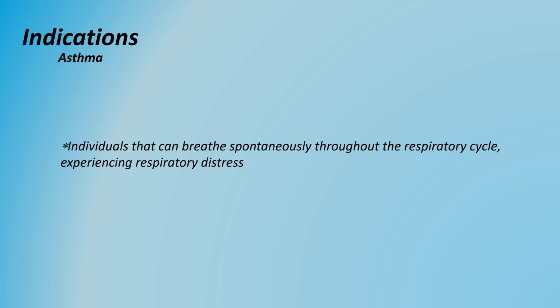In a very broad sense, you can encompass most of CPAP indications with the phrase: individuals that can breathe spontaneously throughout the respiratory cycle, experiencing respiratory distress. Super vague, but I opted to include this because I feel like there is an intimidation surrounding CPAP and also a misconception that your patient needs to be severely ill before receiving CPAP, which is just not always the case. If this broad indication helps you to visualize the larger usefulness of CPAP with respiratory complaints, then cool.